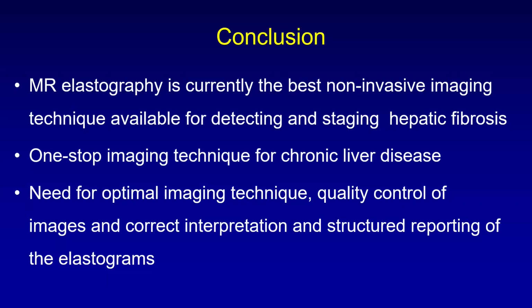You should also have a checklist for your radiographer who is acquiring the MREs, and most of the time one of us has to be on board with the radiographer as of now to ensure that the quality of the MRE acquired is diagnostic.